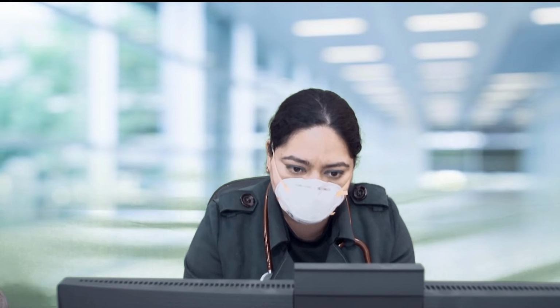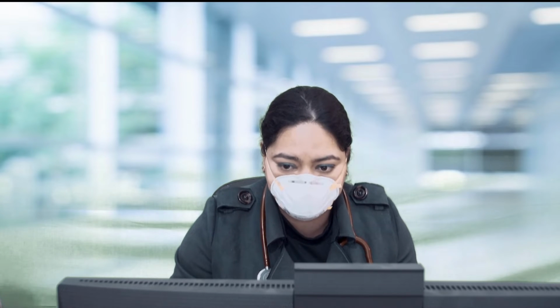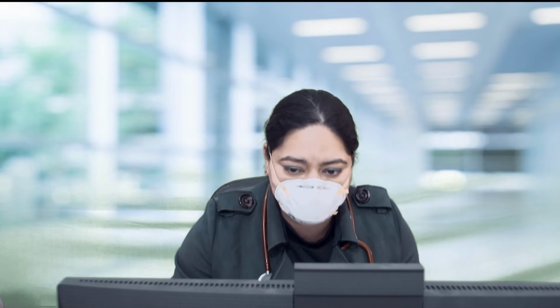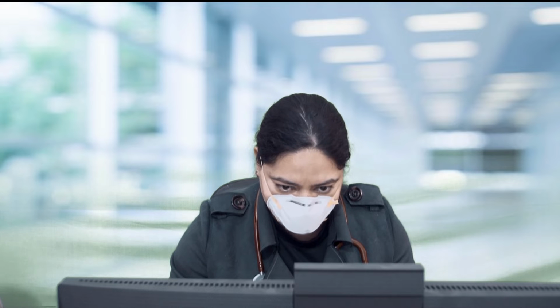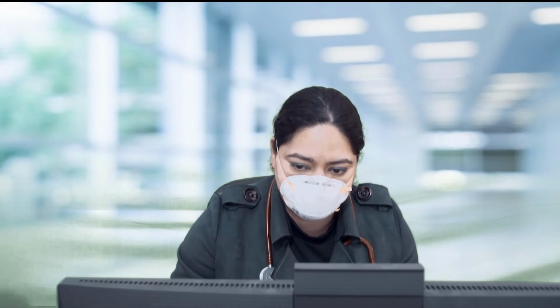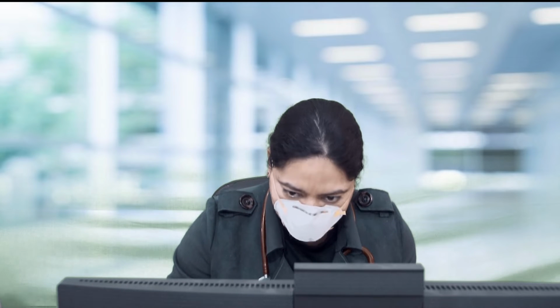The first and foremost are the patients in whom there is inability to protect the airways. By this, we mean patients who are comatose or who have cerebrovascular accident or who are confused and agitated. These patients will not cooperate with the BIPAP interface, so we should not use BIPAP in these patients. Then patients who are hemodynamically unstable, those who have arrhythmia or who have hypotension and are on very high doses of inotropes and vasopressors.